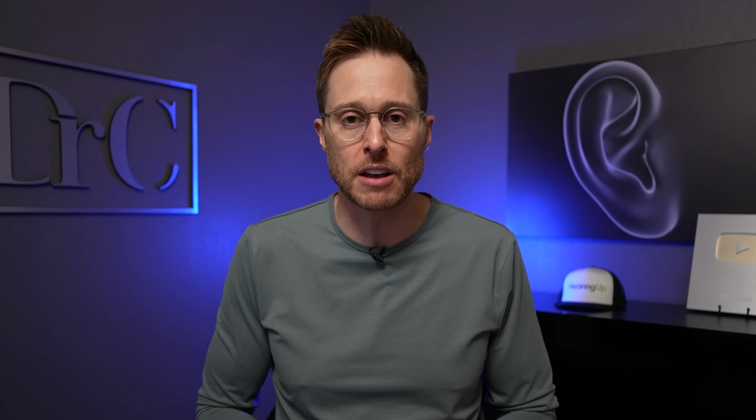You should be going with the highest level of technology that you can reasonably afford. If you cannot afford it, you should be dropping down to the level that you can afford, and then it's the job of your hearing care professional to maximize the performance of those devices for you.